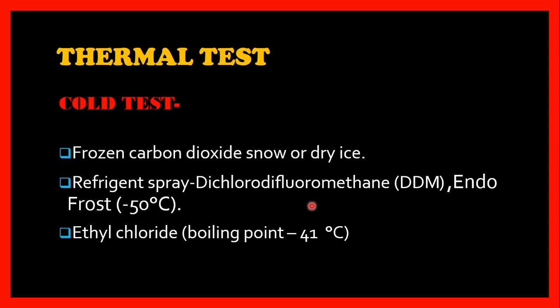What is the mechanism that occurs in the cold test? What happens when we apply a cold stimulus to a tooth? It causes contraction of the dentinal fluid within the dentinal tubules, which results in a rapid outward movement of that fluid.